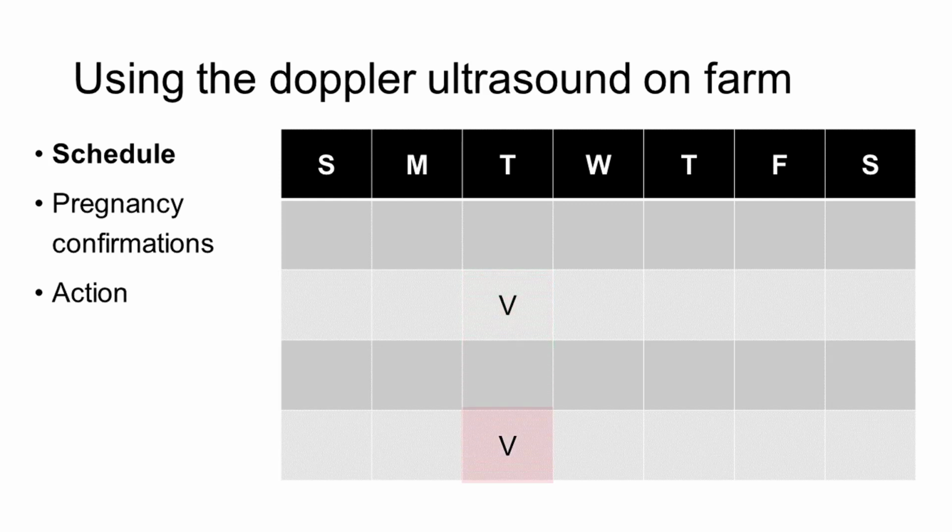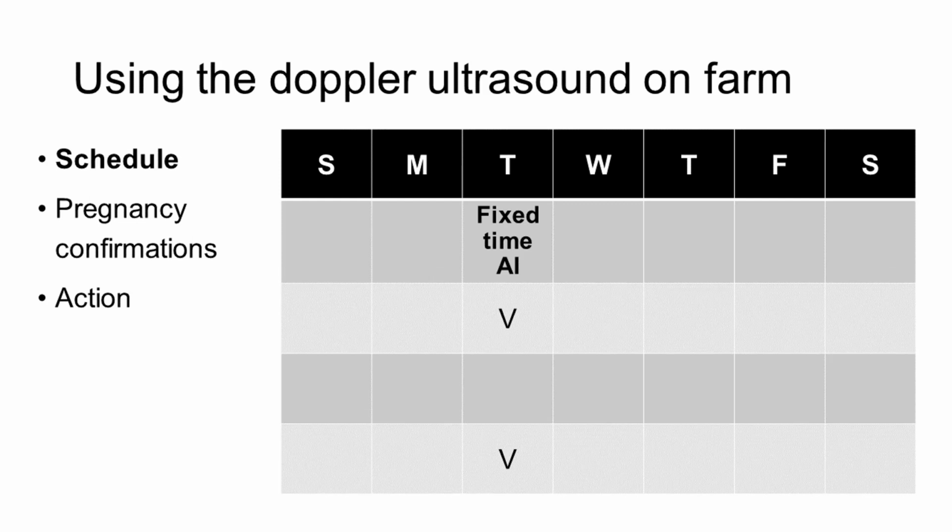The short window of time during which you can use the Doppler ultrasound implies that you could only use it for less than 10% of the cows with an unknown pregnancy status, unless you are visiting the farm every other day, or if the inseminations are at fixed time, 21 days before your visits. Using synchronization protocols is indeed almost necessary to implement the use of the Doppler ultrasound effectively in a herd.